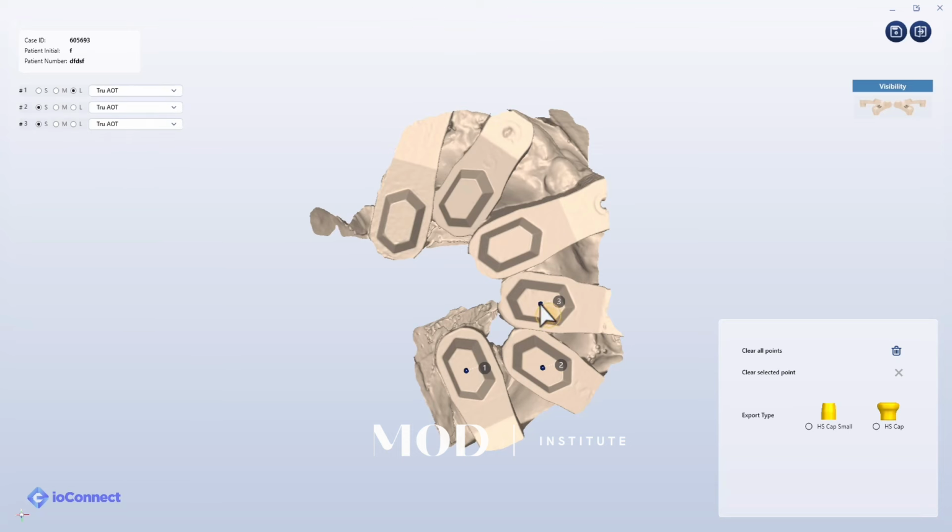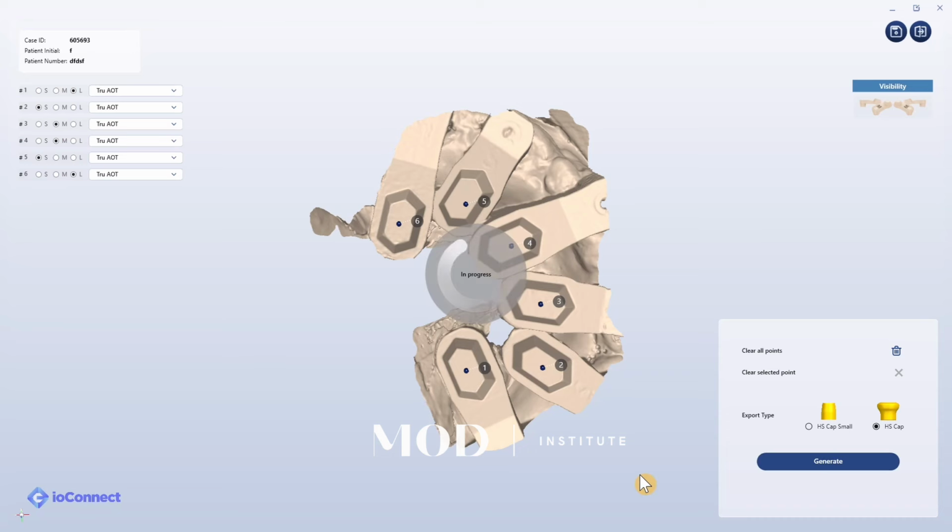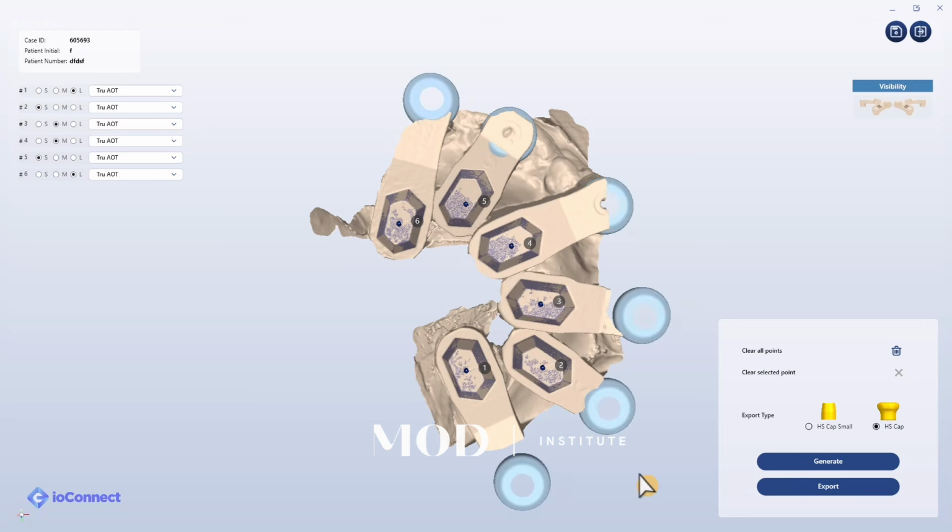Again, I'm doing it for the lower arch. Click the center of the hexagon, tell it whether it's a small, medium, or large, and then export the rendered caps. And those caps that are exported are the actual implant locations from this scan. And so that is why you did not need to actually scan any of the connection where it meets the tissue. You could have just scanned the hexagons in space.